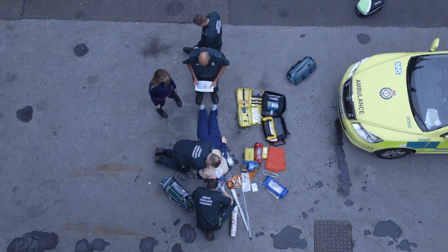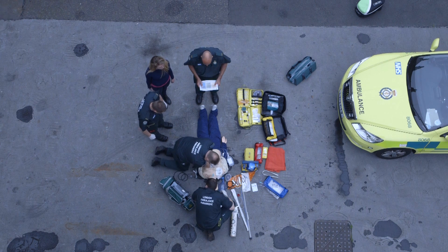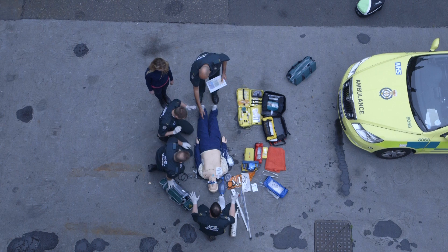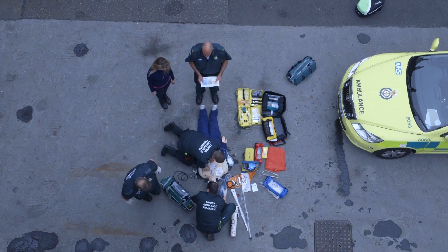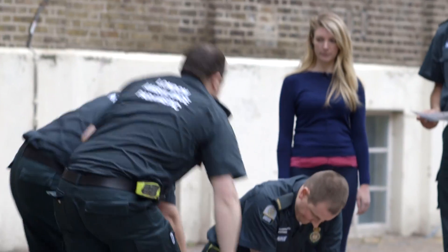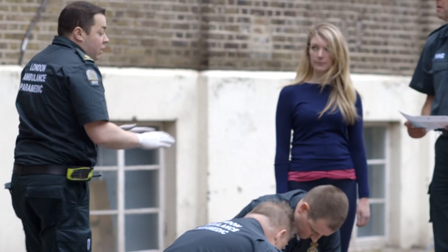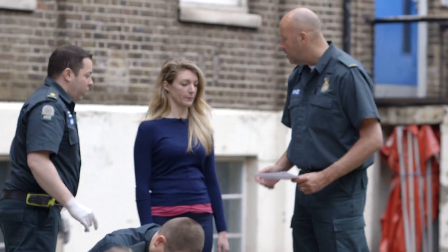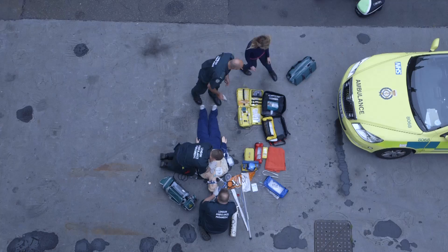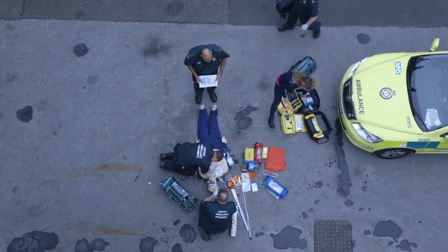Here you can see the Lucas 2 mechanical chest compression device being deployed. When using such a device, it is important that staff are trained to use it effectively to ensure minimal interruption in chest compressions. Paul, will you take over the airway from Nick? I'm happy, Nick, to come in if you're okay. Nick, would you mind deploying the mechanical device? No problem at all. Is it all right if we clear some space? Yes, of course. Catherine, would you mind assisting and just moving all this equipment just back, please? Just drag it all the way back. Thank you.